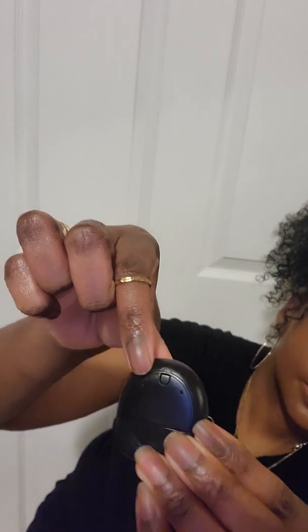Oh, I forgot to show you the button. When I take it off, it shuts off by itself. And to turn it on, I'll show you the button. When I press this button right here, this light will come on. It's yellow now because it's off. But when I put it back on, it's green, and that signifies that it's working properly. So that's my console.